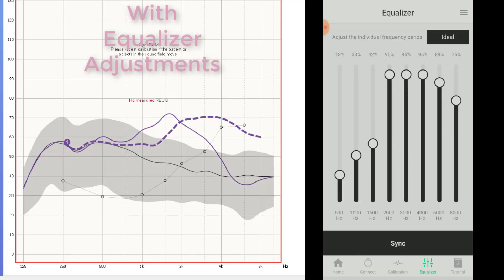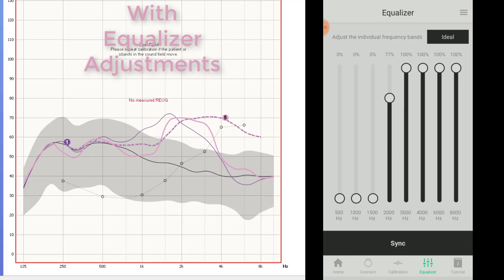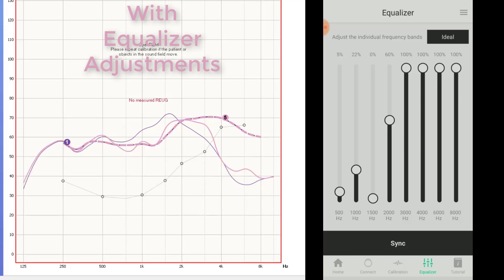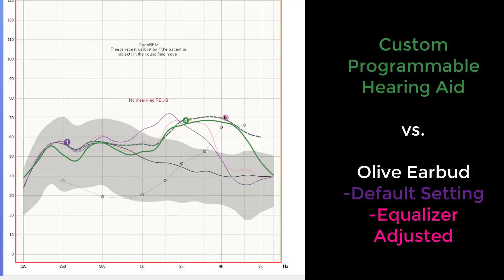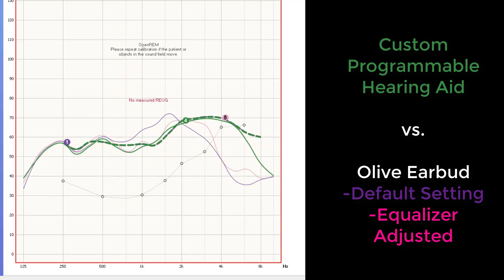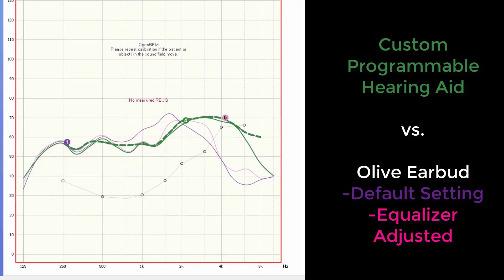However, this is what the equalizer is for. I spent some time trying to adjust the equalizer to match the amplification of the Olive earbud to the hashmark prescriptive target line while in default mode, shown as a solid pink line for comparison. This is as close as I could get — not horrible, but not great either. For comparison, I also measured a custom programmable hearing aid to show how well a high-quality hearing aid can be programmed for the same type of hearing loss, indicated by the solid green line. As you can see, we can do a much better job of matching a prescriptive target, which results in a significantly higher rate of satisfaction.